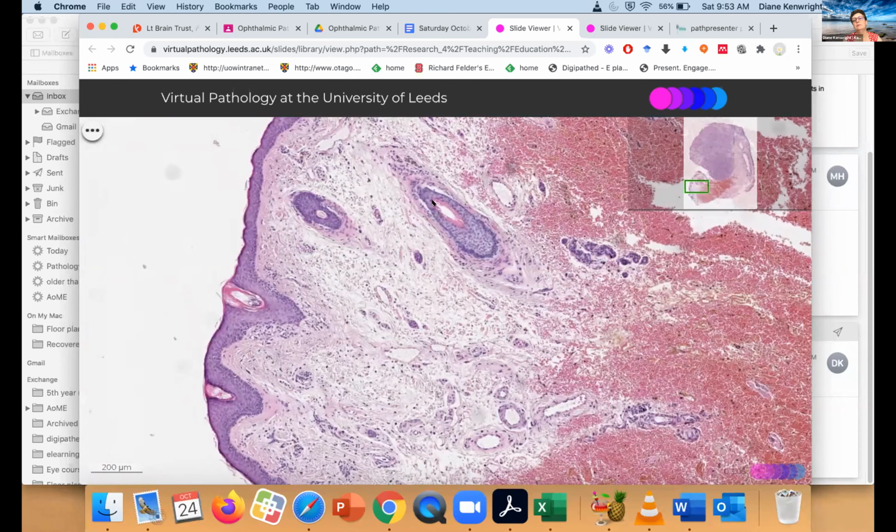So one of the questions is, how do you know it's not a Merkel cell carcinoma? Okay, Merkel cell carcinomas, good question, because they can occur on the face. They don't have an epithelioid phenotype when you look at them down the microscope. They're small, round blue cells. They're very, very tiny. We should probably quickly look one up, shouldn't we, to show at the next break.